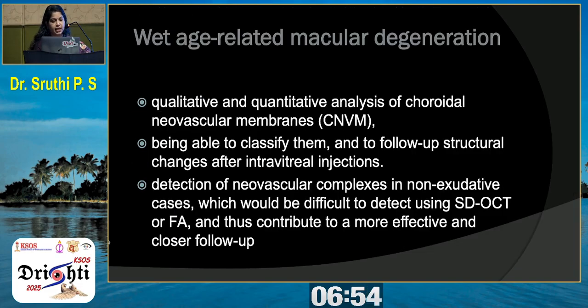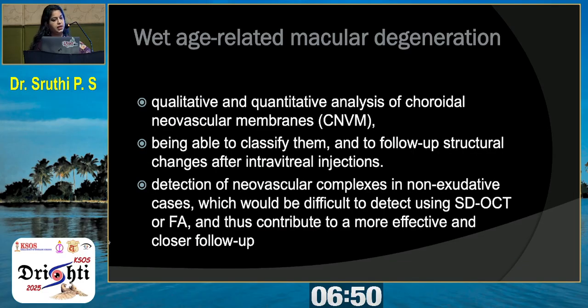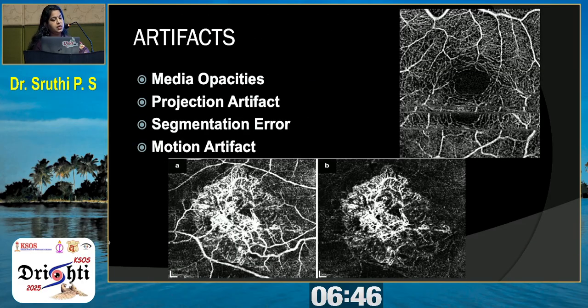The clinical applications include diabetic retinopathy, age-related macular degeneration, retinal vein occlusion, and MACTEL. It basically helps to analyze the non-perfusion areas, the neovascular bundle, and the foveal avascular zone can be quantified. So we will get an idea about how to proceed with the management.